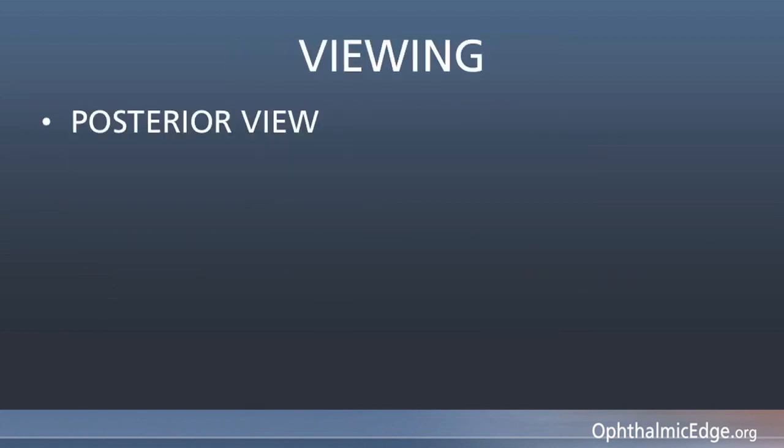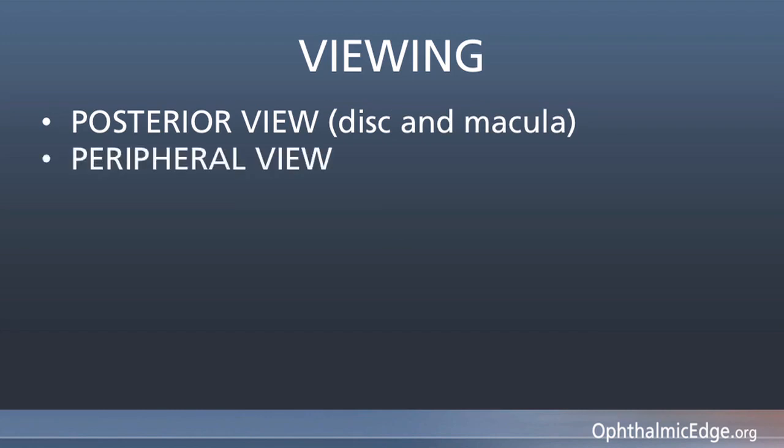Viewing the posterior pole, disc, and macula is the beginning, and then moving—not rotating—the scope inferiorly left and right will allow you to see the lower portion of the eye. You may have to torque the scope slightly, but you have to be gentle as you do it and usually retracting the scope slightly. Whether the patient is pseudophakic or not will determine how far forward you can come without shanking the lens if one is in place.